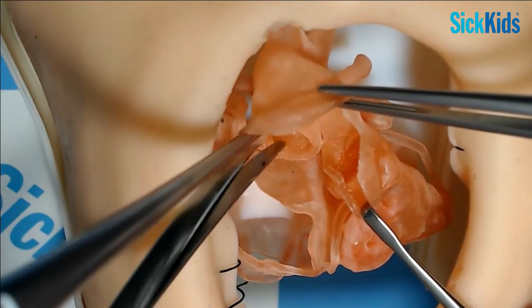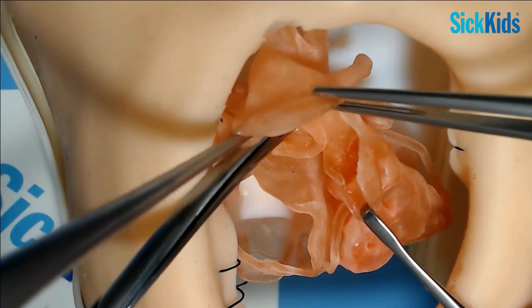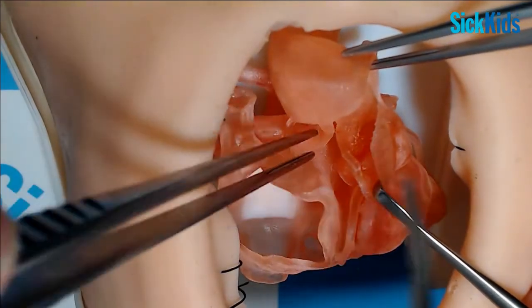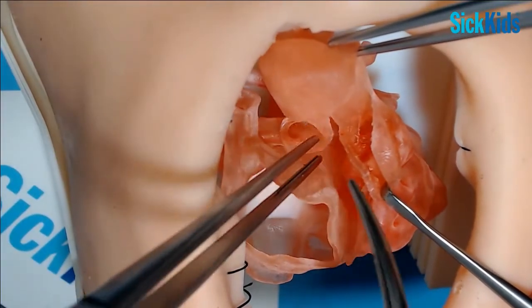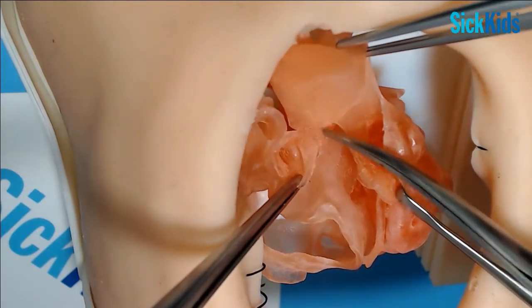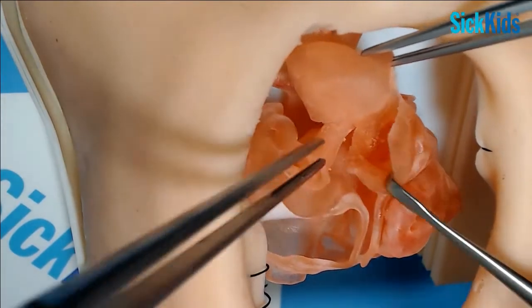And there's quite a nice ridge. But you want to take your time. Often you've got a bit of blood coming back, so you have to make sure you've got control distally of the pulmonary arteries, so you've not got blood coming up. You want to see everything and just be prepared to drop your flow if you need to. And there they are, they're off.